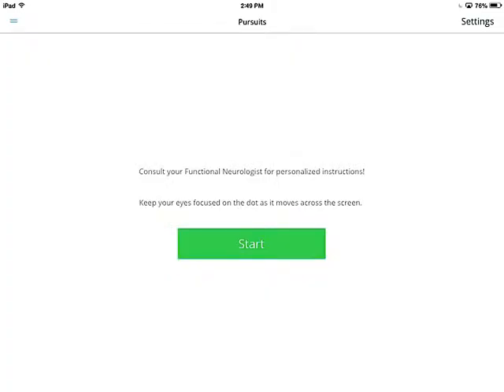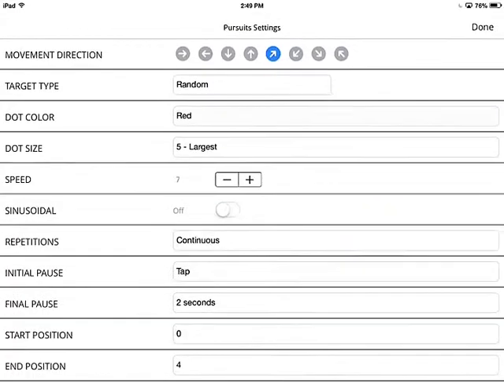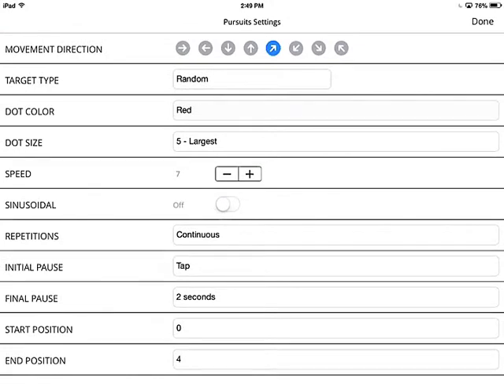First, let's take a look at pursuits. When you go to settings, you can see that you can very easily change the direction of movement of the pursuit by selecting the desired arrow. In this case, I'm going to select the direction to the left, so the movement will go from right to left.